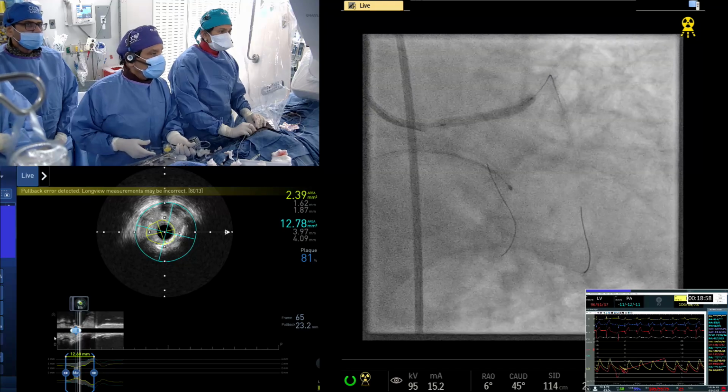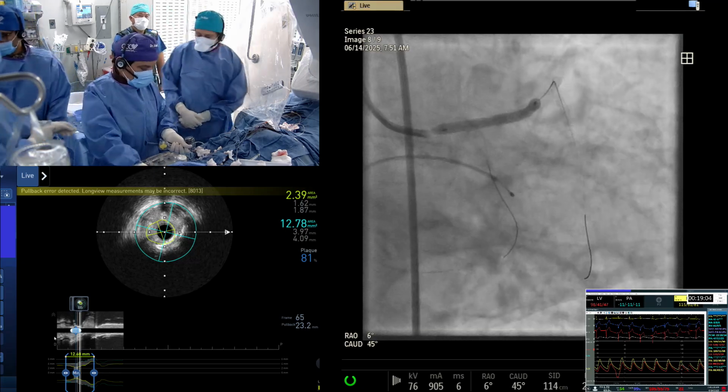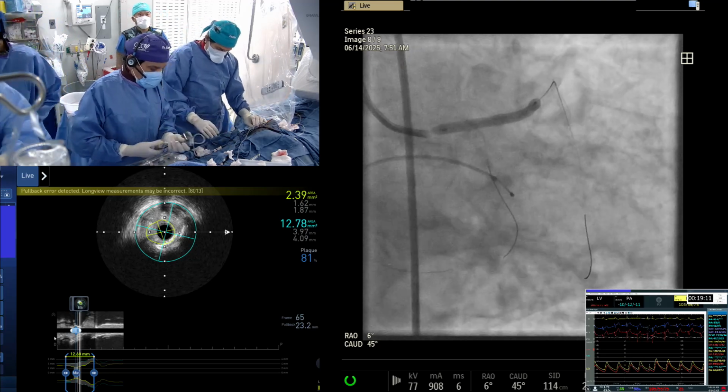Yeah. No, that's why I wanted 4, but he was insisting, no. 4 at low pressure, and then proximally we could have gone 4.5 anyway. One second, one more.